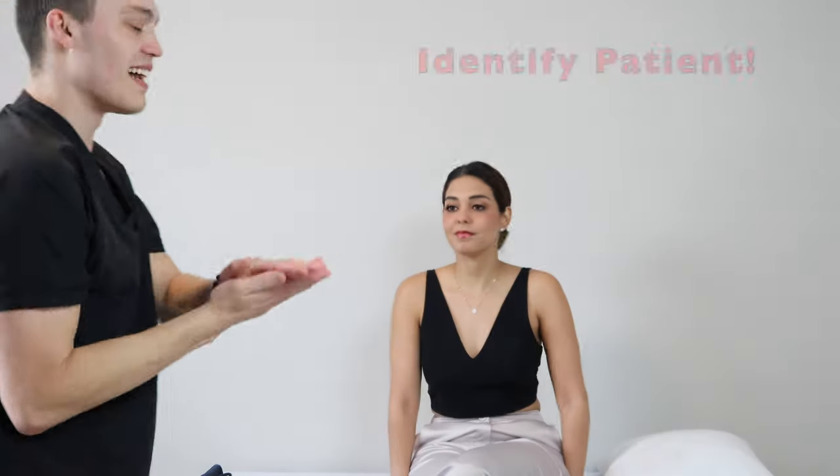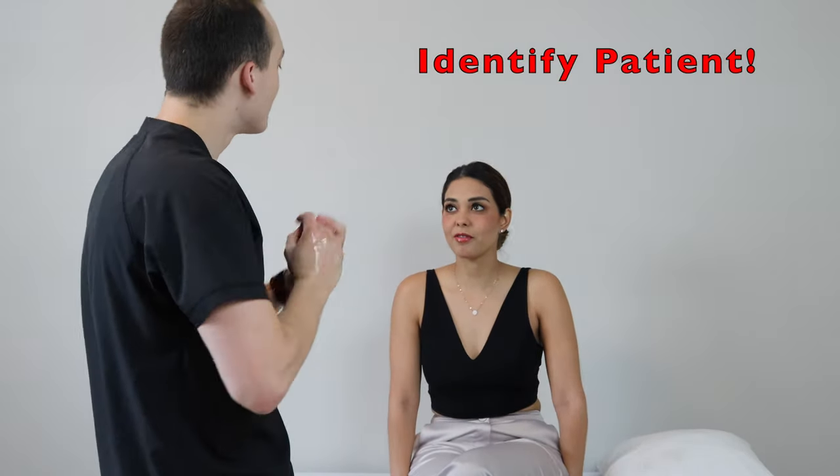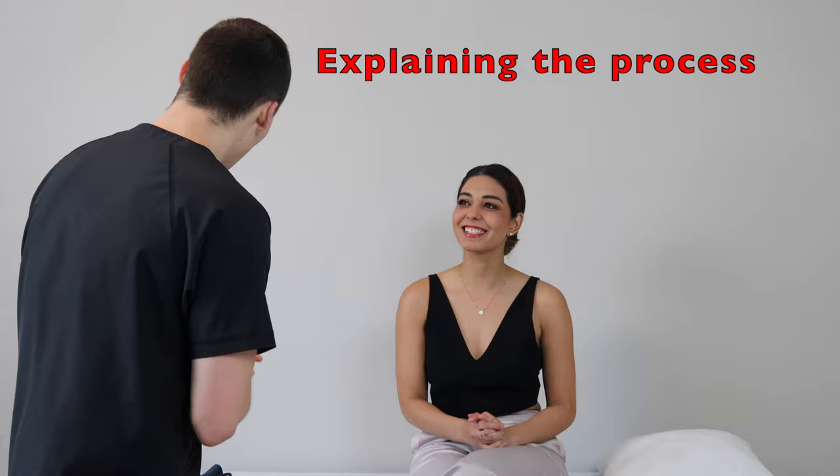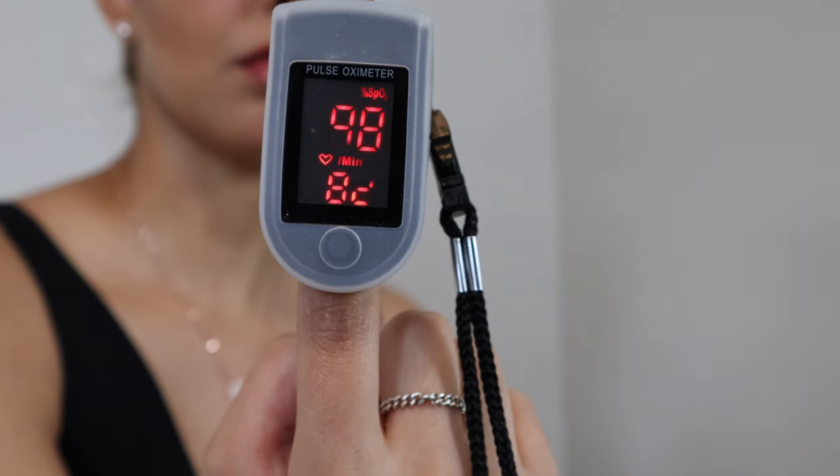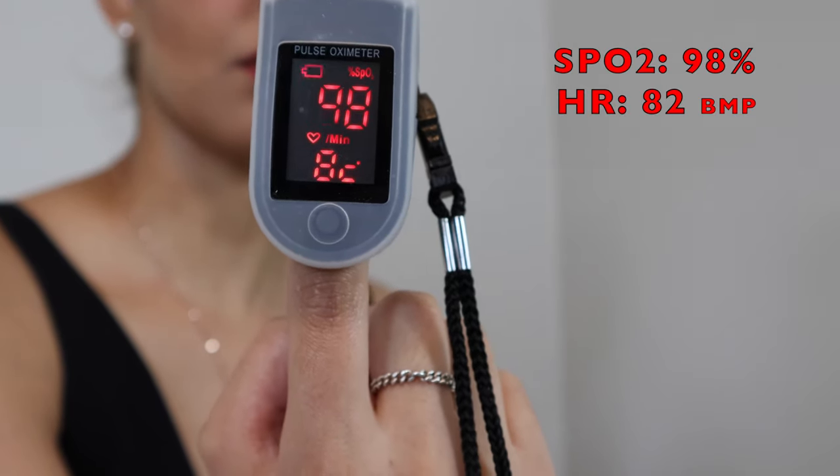Let's do this. So we're going to go ahead and take a quick set of vitals. First, hand hygiene. Then identify your patient. Can I have your name and date of birth, please? Jennifer Cameron, July 11th, 94. Matches my records — they're imaginary, but they're here. So we're just going to be taking a quick set of vital signs. You're going to need a blood pressure cuff, also known as a sphygmomanometer — it's complicated to say — a pulse oximeter, and a thermometer. We're going to start with the pulse oximeter. Her pulse oximeter is reading 98 and her heart rate is 82.